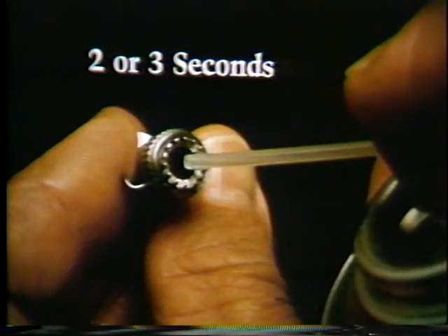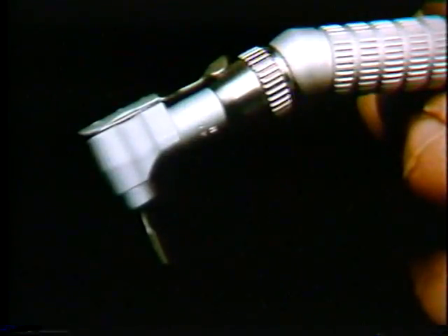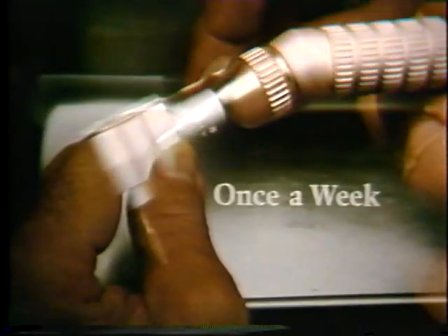Reinsert the drive shaft back into the contra-angle. Place the contra-angle back on the attachment. Insert a burr and run the motor for a few seconds.